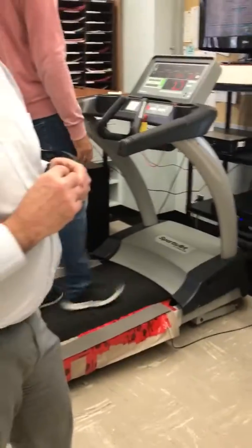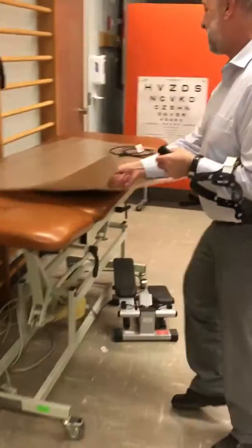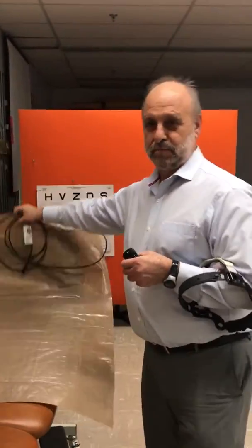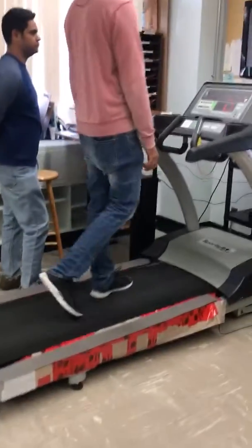Now we're using the Vista sensors underneath, which you pointed out to me, wrapped into the Teflon. This is what we call a skin, and it's just put under the treadmill. The belt goes over the skin just as though it would go over the metal.